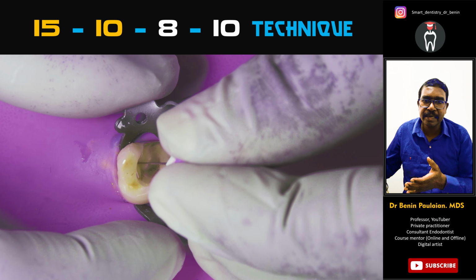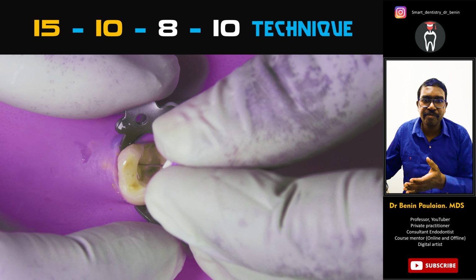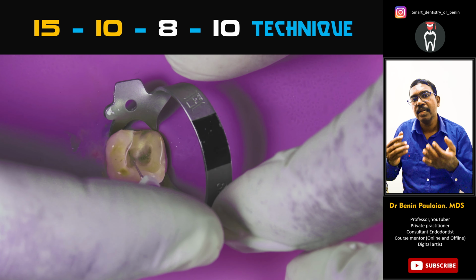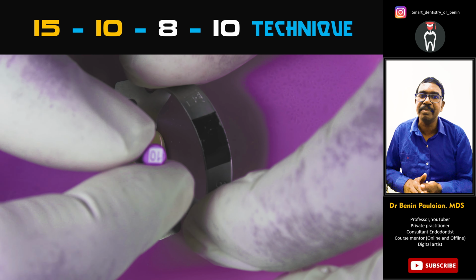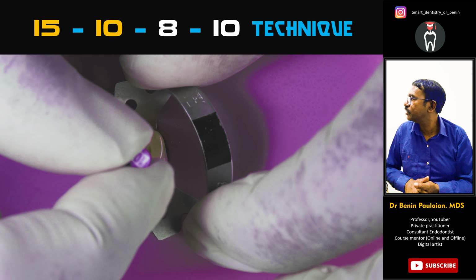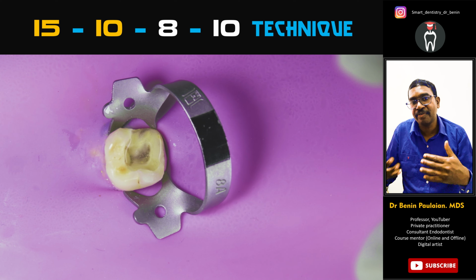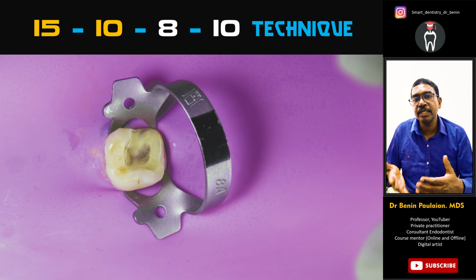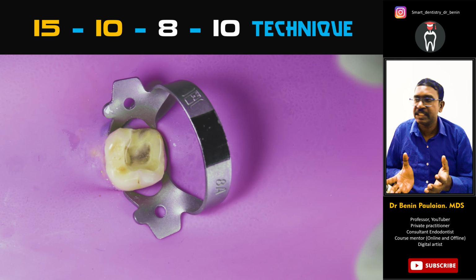In the same way I used a 10 size file, and a 15 size file earlier, here I will be using a 10 size file but going deeper up to the middle third of the canal. Again I will be using only the watch winding motion, and if you find the canals are quite wide enough, then you may use a little circumferential filing.